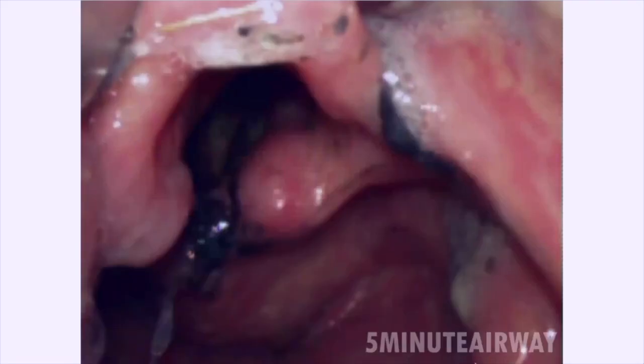And so I agree, there is some swelling. You can see the swelling of the arytenoids even on this slide here. And this is one where, with that increased vascularity, any kind of additional manipulation is probably going to just start ballooning up. Okay, good. Let's see what happens next.